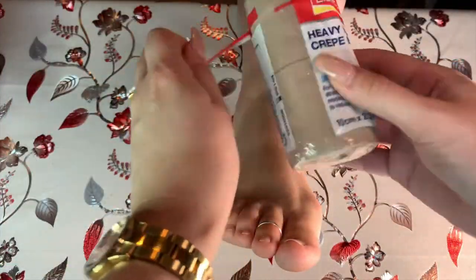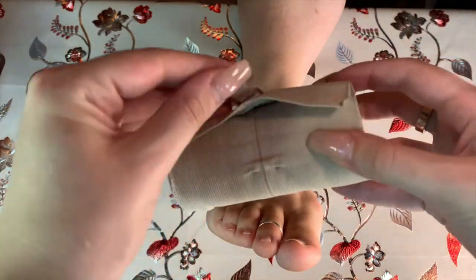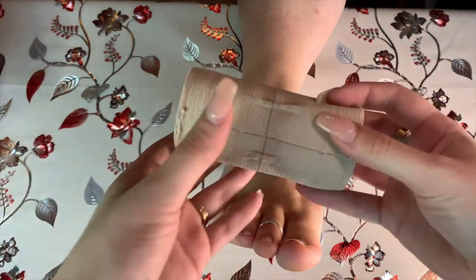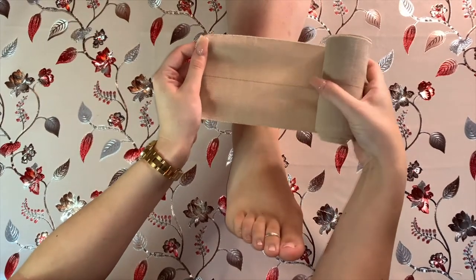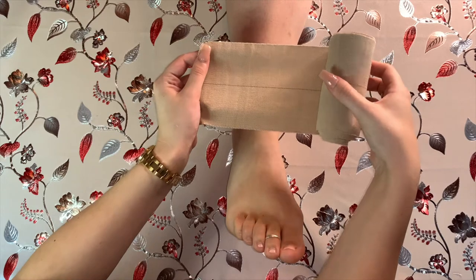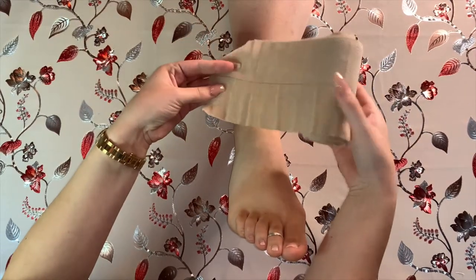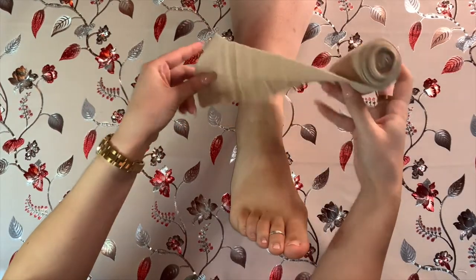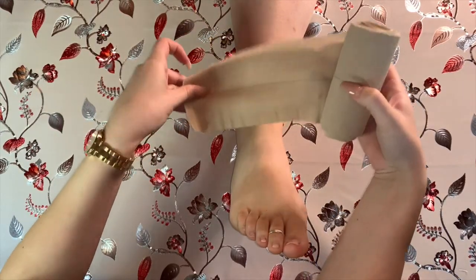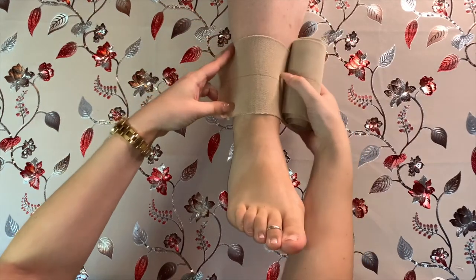First of all, take the bandage out of the packet and remove the elasticized clip. You can choose whether to use this later or to just use the cloth tape, but for a child I definitely wouldn't recommend it. Start with the roll of bandage in your dominant hand, with the stretched-out part at the bottom of the roll so it rolls out from underneath. This is important so that if you drop the roll you can quickly catch it — and having it the right way up also gives you better control for bandaging.